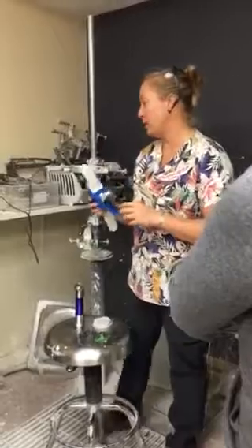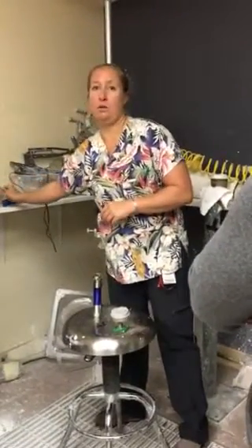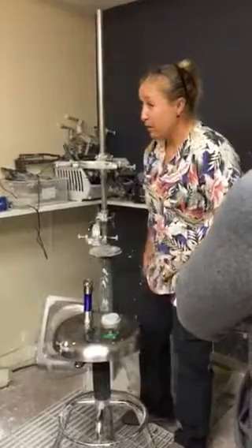This room gets really smelly and there's no ventilation in here, so it's not a good place to be using the resin. Does anybody remember how to do this?